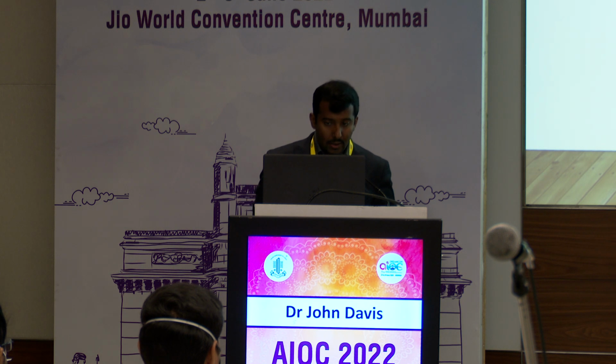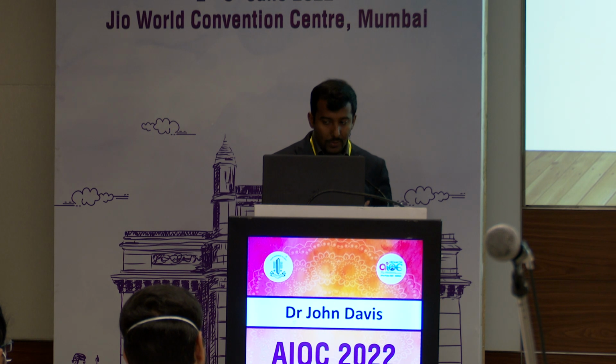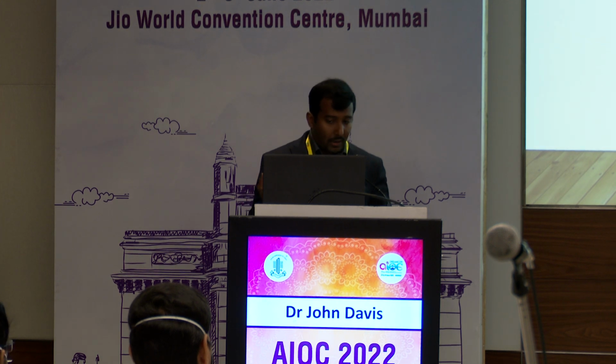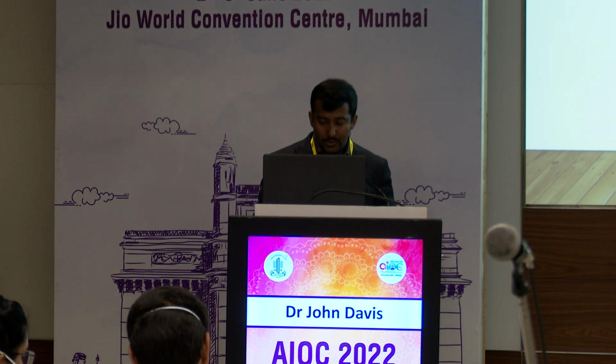Firstly, ophthalmology has a lot of imaging and measurable big data, which is ideal for application of artificial intelligence. And AI has been used for detection of diabetic retinopathy, glaucoma, ARMD, retinopathy of prematurity, retinal vascular occlusions, other retinal diseases, in addition to keratoconus, measuring, calculating IOL power, and several other parts of ophthalmology. And AI is considered complex, expensive, and out of reach for most people. So we propose to create an AI algorithm using free online tools. So it was to develop an AI algorithm that can detect retinal diseases from fundus photographs and evaluate.